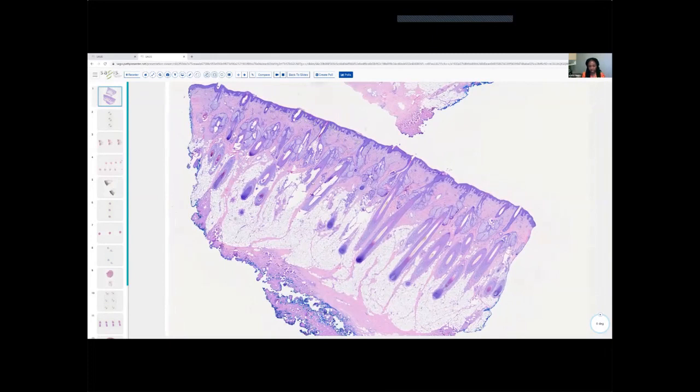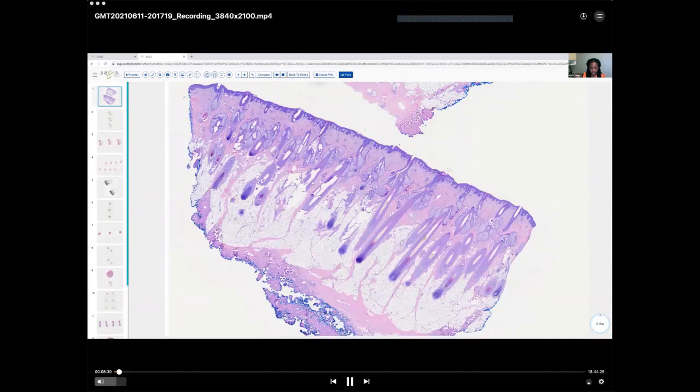So again, it's useful to really understand the structure of the skin, and specifically for this topic, the scalp. The features that we're going to be discussing, I'm going to show you with some examples in vertical sections, basically top down, just as we're seeing the skin here, and some of them in horizontal section. I'll explain in each case what the pertinent features are that you can see in each scenario.